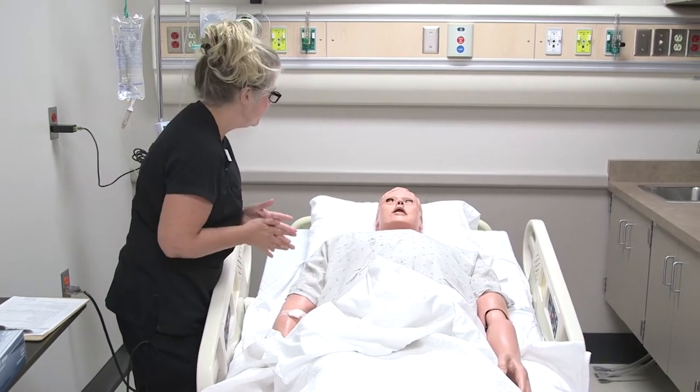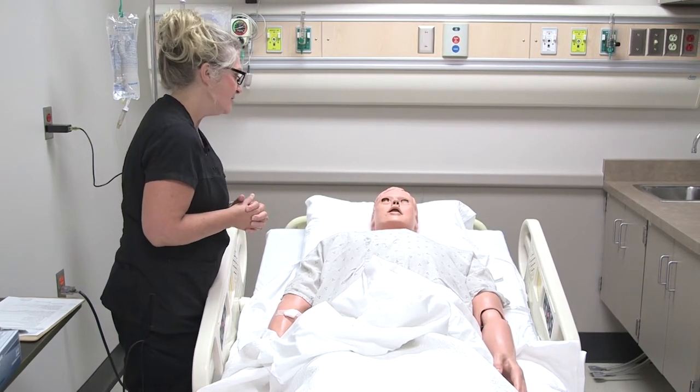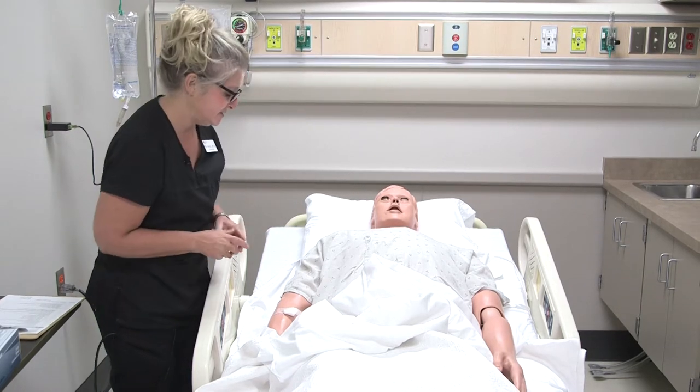Okay. Do you have any allergies, Tim, that you're aware of? Nope. Okay. Good. Would you prefer me to call you Tim or something else? Tim. Okay. That's what we'll do then.